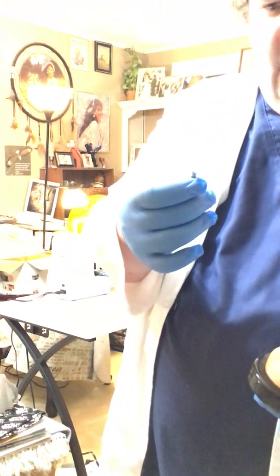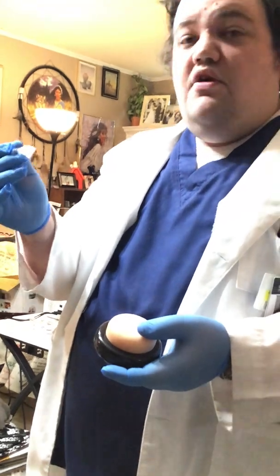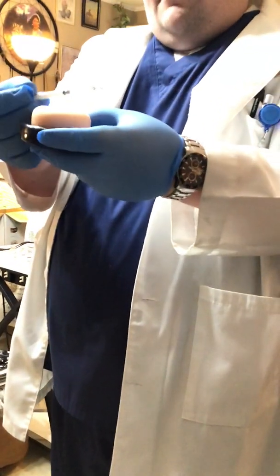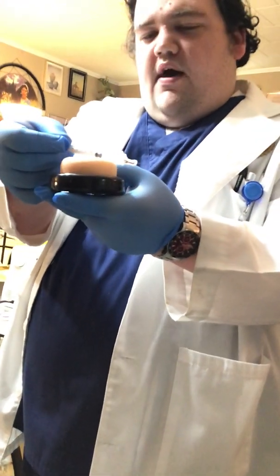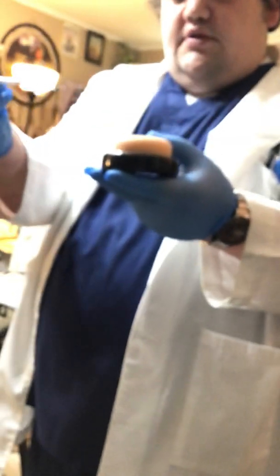I'm going to go bevel up, and I'm going to go no more than 5 degrees. Get the liquid off. If you picture a protractor, this is 0 degrees. 1, 2, 3, 4, about 5. That's the angle I'm going to go in, very close to the skin. I'm not going to go deep. I'm just going to go barely in there. Lift up.